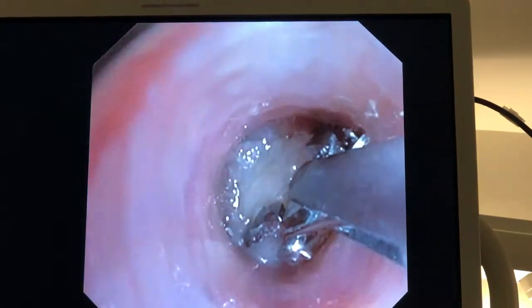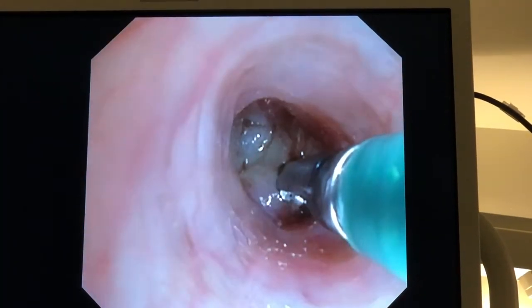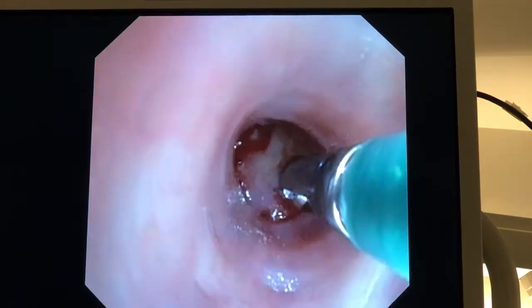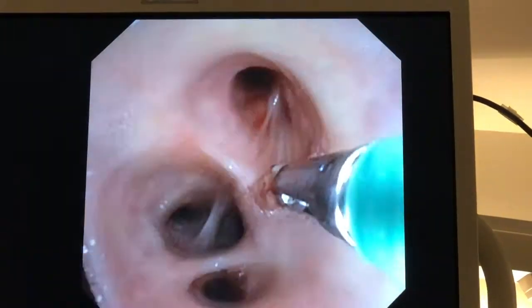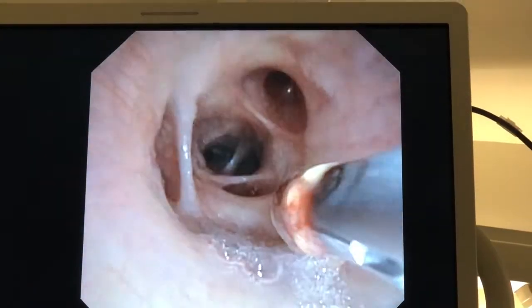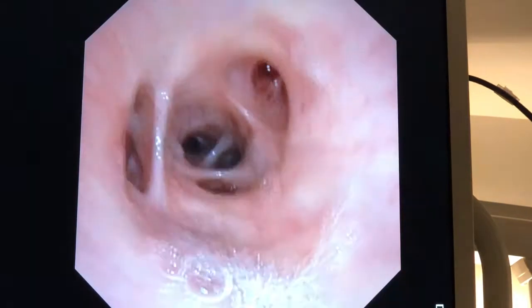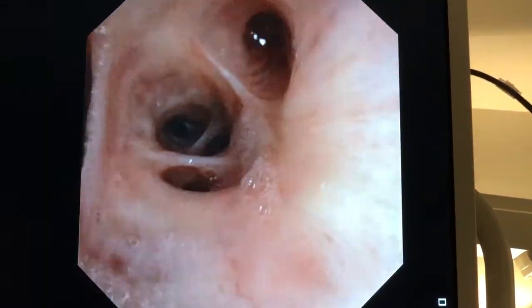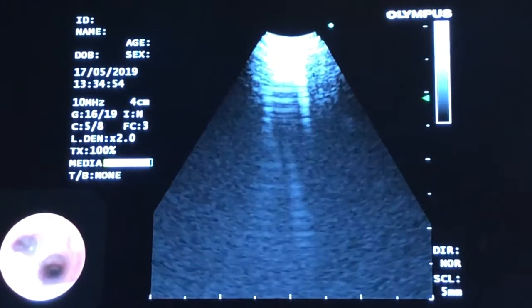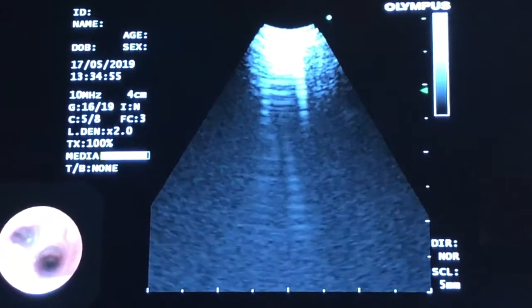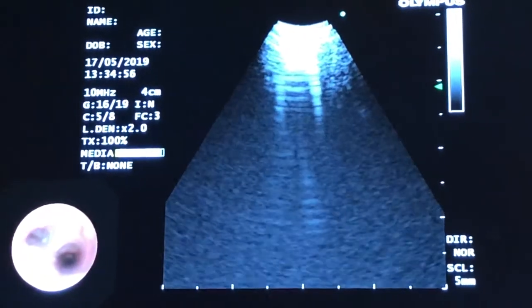The first biopsy is always the easiest because once you take your first biopsy there's always a little bit of bleeding. You can see we've got quite a big biopsy there. You can remove that. There's hardly any bleeding, just a little bit as you'd expect.